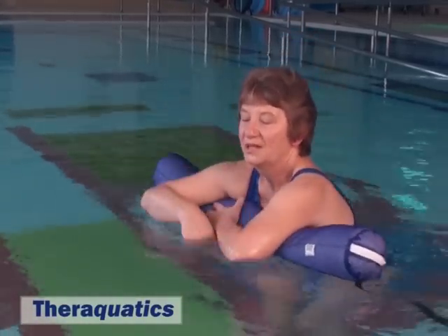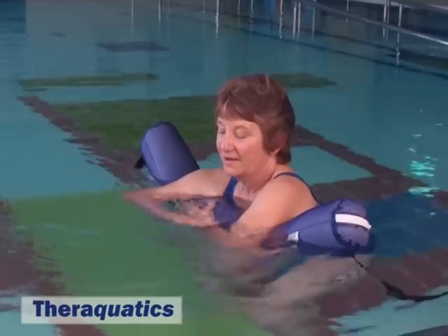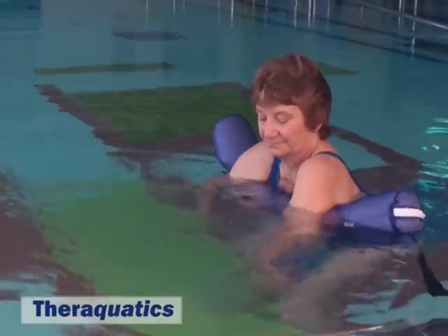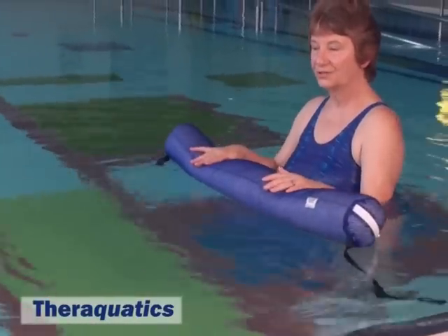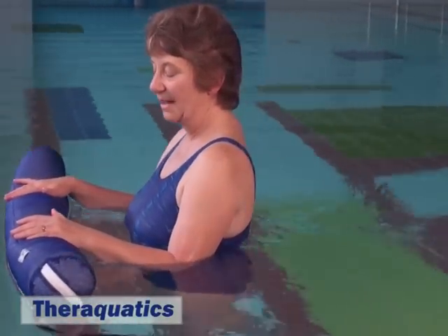Sinking down in the water and supporting under the arms is another position where you may get good use of arm exercising techniques. It may also be used as a support for walking across the pool and maintaining a little extra balance.